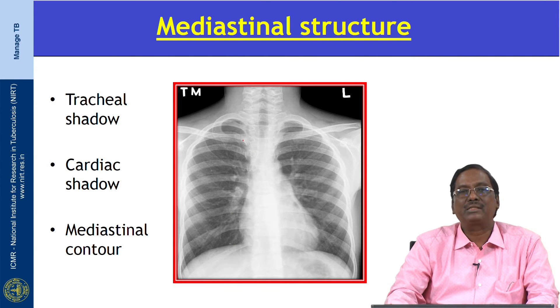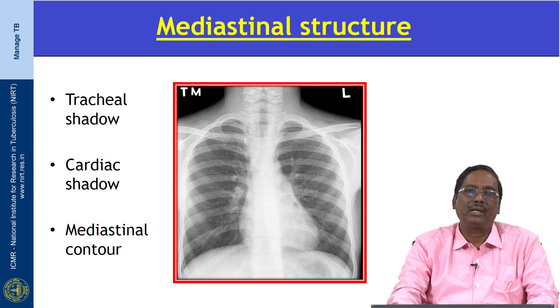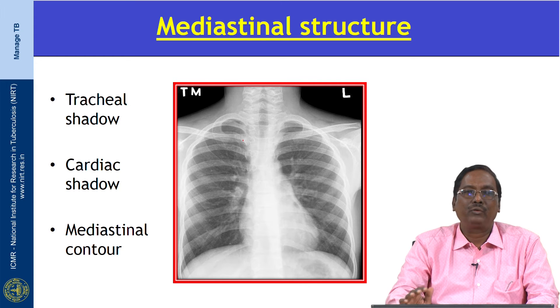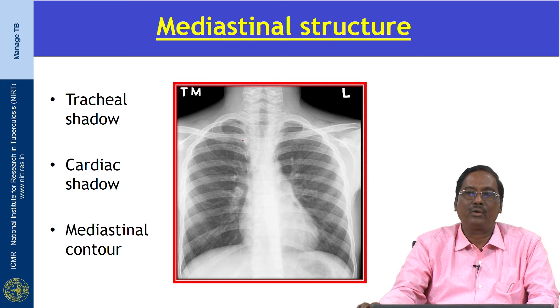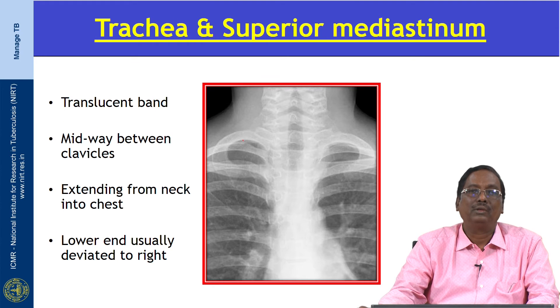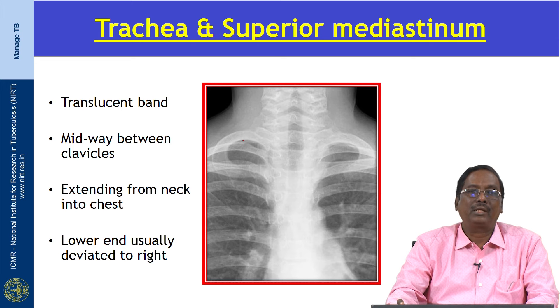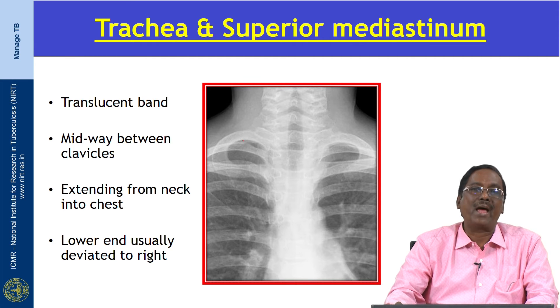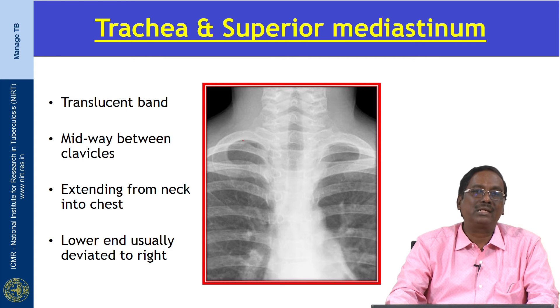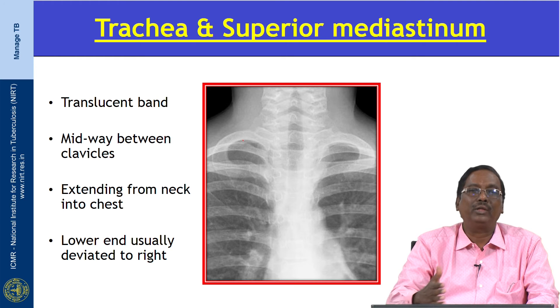Next, we have to see the mediastinal structures. The upper part of the mediastinum contains the trachea. We have to see the tracheal shadow, cardiac shadow, and mediastinal contour. First, inspect the tracheal shadow and superior mediastinum. The trachea occupies the superior mediastinum, appearing as a translucent band. It lies midway between the two clavicles and extends from the neck into the chest. The lower end of the trachea is slightly deviated to the right side — this is normal.